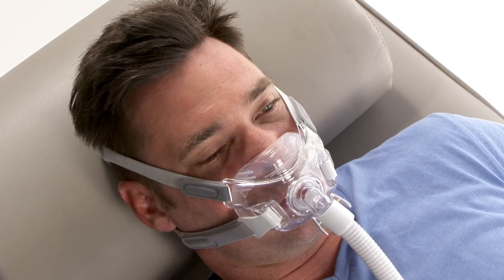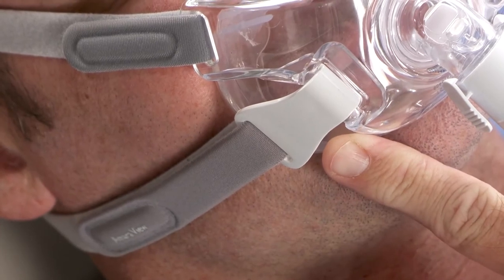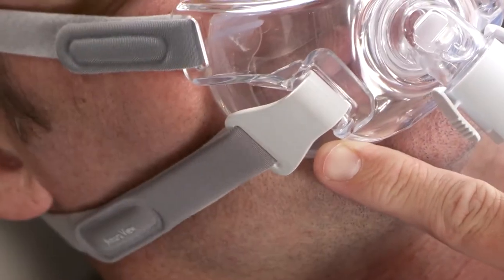If a leak is still present, apply pressure with a finger in the location of the leak. If this eliminates it, slightly tighten the strap closest to the leak. Be careful not to over-tighten the headgear.